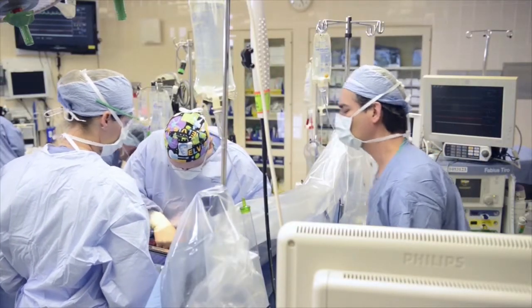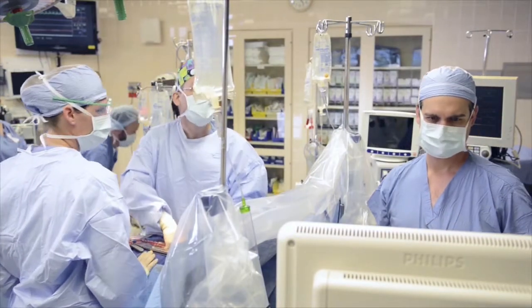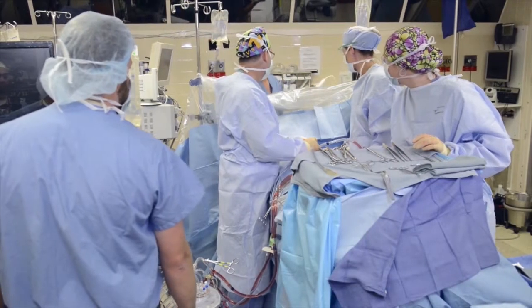The aorta looks blue. The aorta is blue and hard. Doctor, do we have a dissection? Can you look at the echo? Yes, there's definitely a flap in the ascending aorta. There's definitely a dissection.